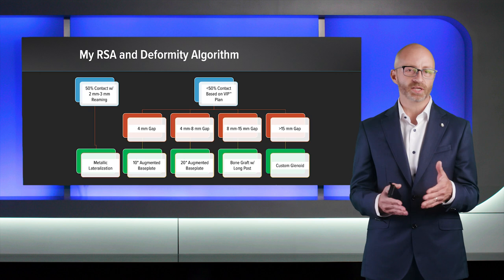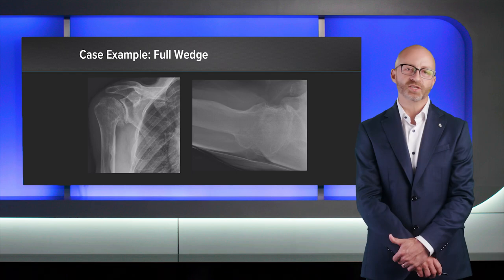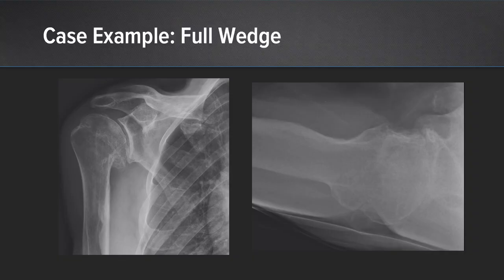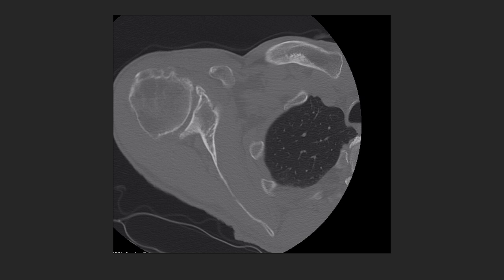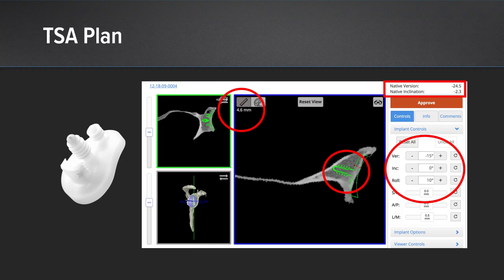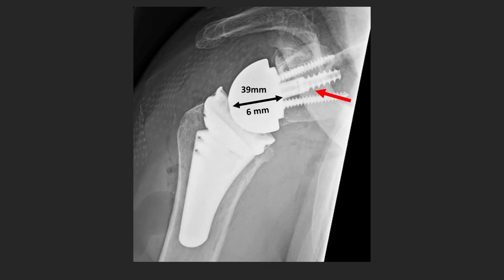Here are the case examples. This is an individual with a B2 glenoid and posterior subluxation visible on CT. We plan this in VIP and first look at what we can do with an anatomic glenoid — to get contact, we have to ream over 4 millimeters of bone, violating the subchondral bone. In addition, we have significant posterior subluxation, so we move to reverse shoulder arthroplasty. With just 2 millimeters of reaming, I can get complete contact with a little accepted retroversion — so this is a patient where I'll accept metallic lateralization.